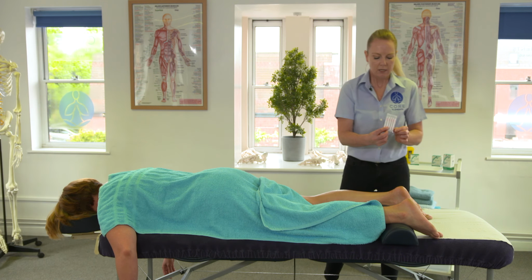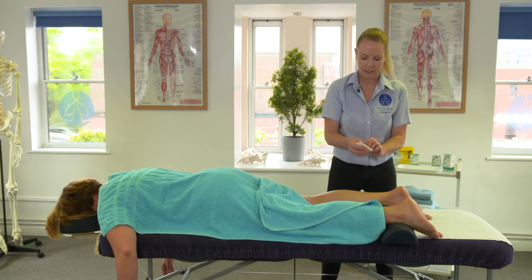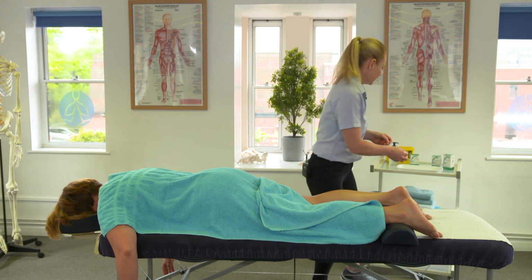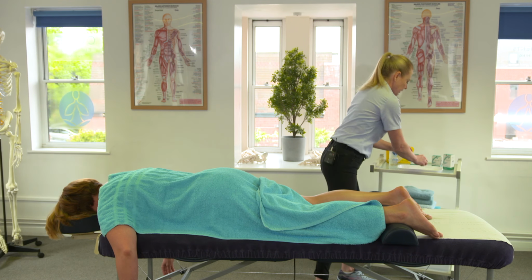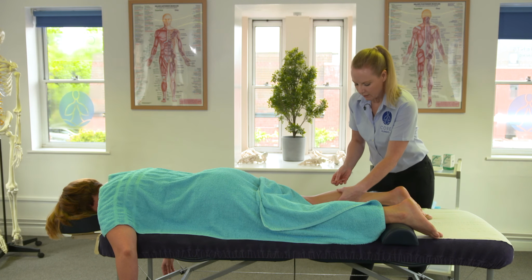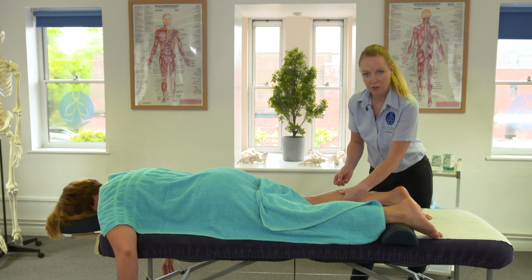Okay, so these are our 25 millimetre needles, and these are Classic Plus needles. So they've got a stopper at the top there. I'm just opening them up. These are guided needles that I'm using. So we know that they're sterile and they're guided with the tube. I'm going to come for this common trigger point first. So I'm going to place the needle into the common trigger point first.